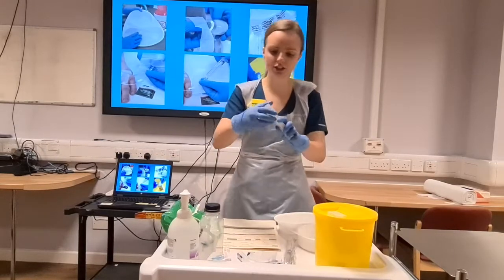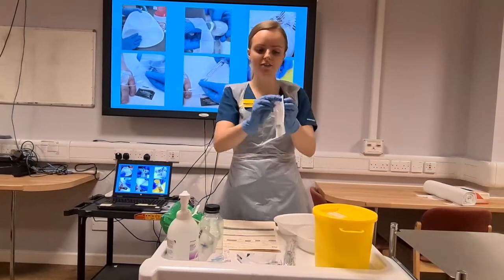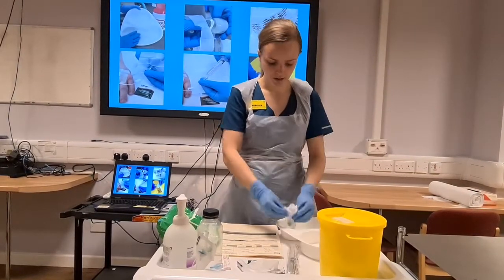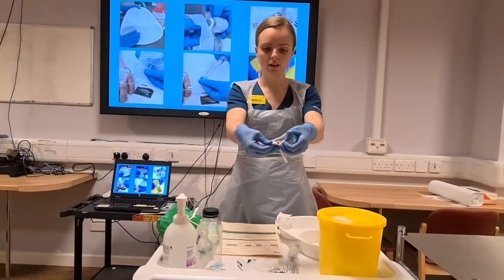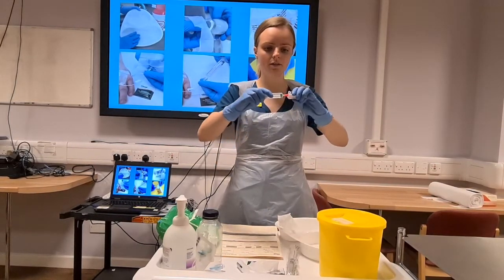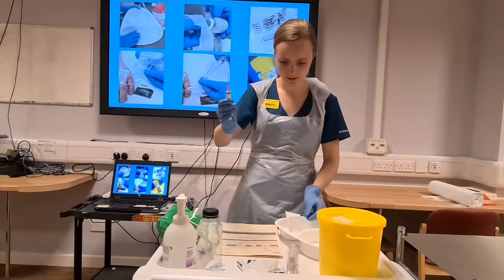Going to get my syringe. So remember, protecting your key part. My key part is down here, so I'm going to open it the other end. Peeling it open, never break through the packaging. It's not worth it. I'm going to open it up like so, get my needle, opening it up, and then placing it on. That's it.